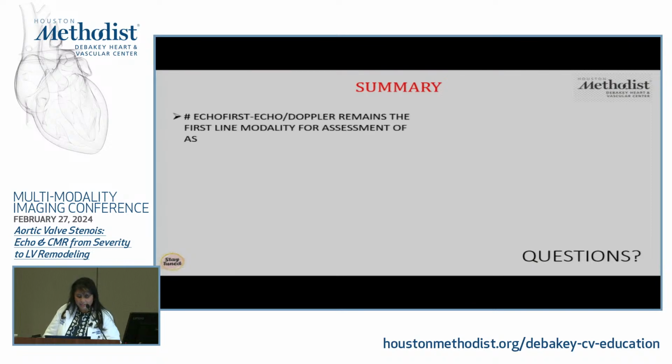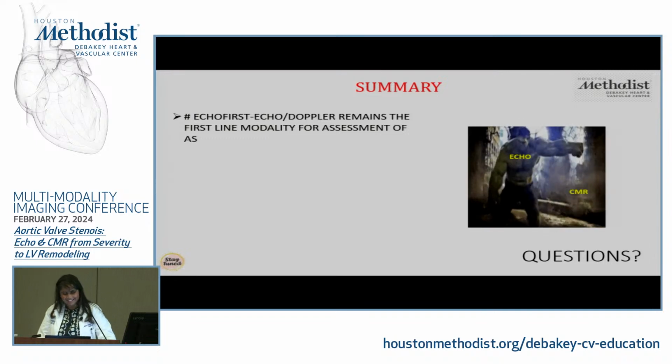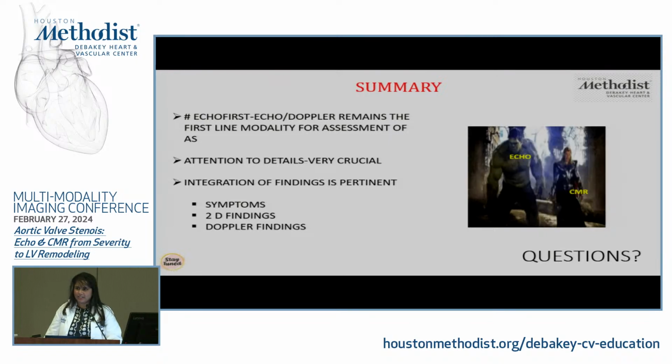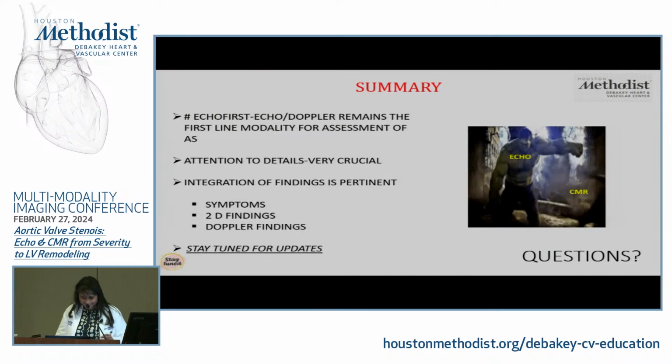Quick summary, I should say, always echo first. Echo Doppler remains the first line modality for assessment of AS. Attention to details, very crucial. And integration of findings is pertinent, right? Always remember symptoms, 2D findings, and Doppler findings. Sorry, Dr. Nabi, I had to do that.